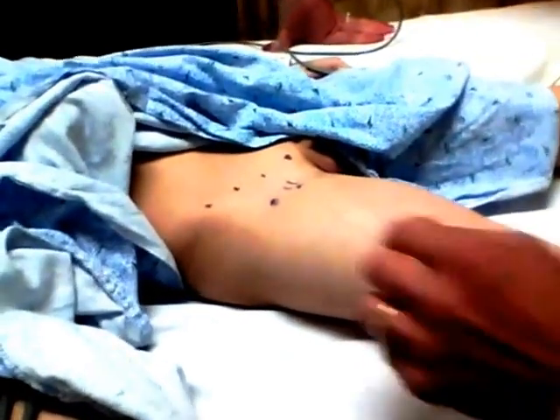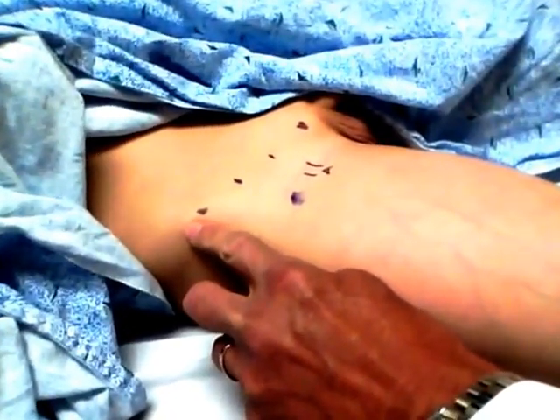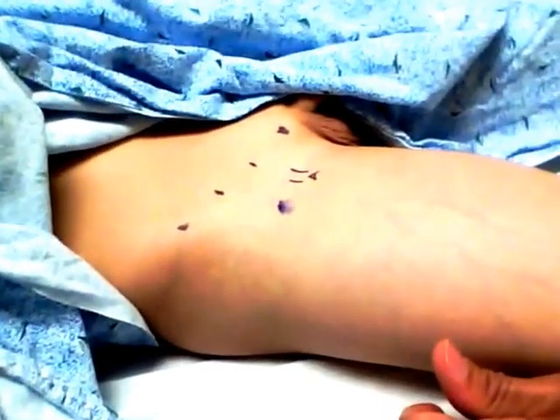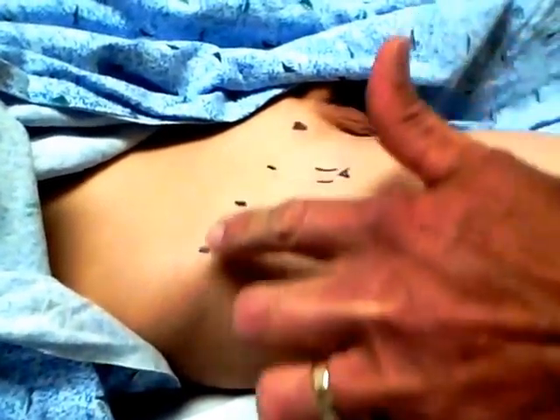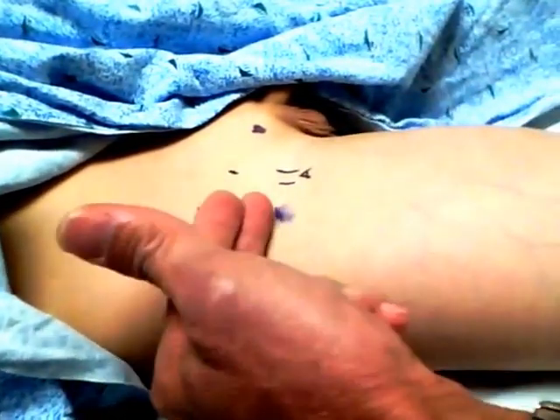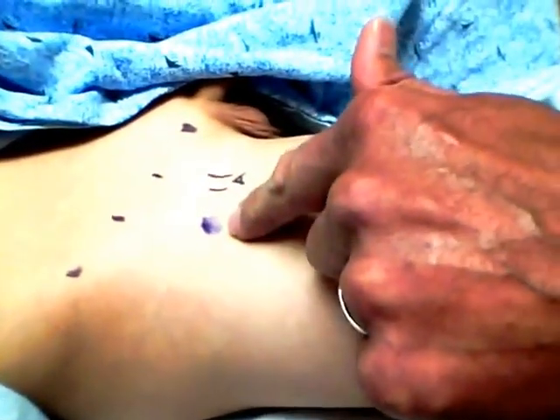You can see the area marked out. What you're looking for is the space between the anterior iliac spine, the iliac crest, and the lateral border of the pubic symphysis. You want to go two-thirds of the way out between the pubic symphysis and the iliac crest, and then about two finger breadths down. The artery is marked here and this is where we're going to go in.